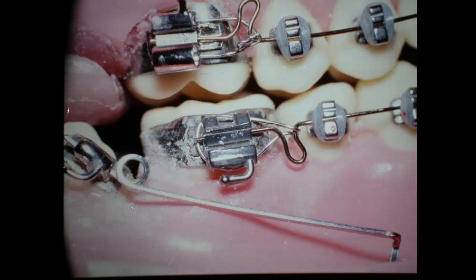This is a rectangular wire here. It's a 1725 arch wire, so it's stainless steel. It's a regular stainless steel rectangular arch wire. And we take a tooth that is impacted or tilted over in almost any way you want, and you can straighten these teeth out using this technique.